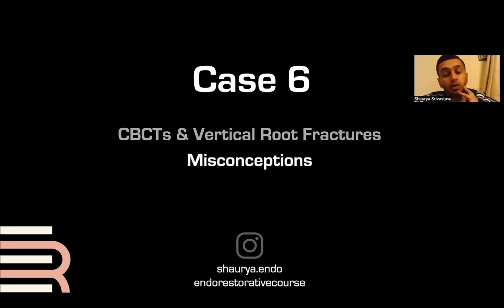So the misconception, as I just spoke of, you cannot diagnose it based on just looking at a scan. You have to do your clinical testing, probing depth, pattern of periradicular bone loss associated with it, as well as the fact that when we talk about J-shaped lesions, all J-shaped lesions are not vertical root fractures. And again, I will show you about 10 cases why. Okay.